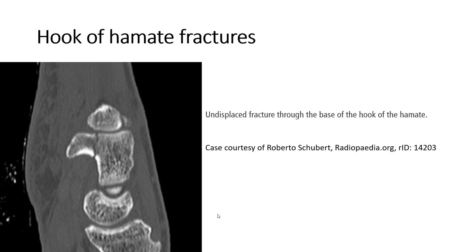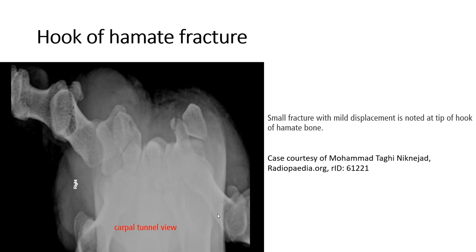In the example shown, a wrist CT demonstrates a fracture line through the base of the Hook of the hamate. This is the carpal tunnel view of the wrist, where we can see the fracture line through the tip of the Hook of hamate.